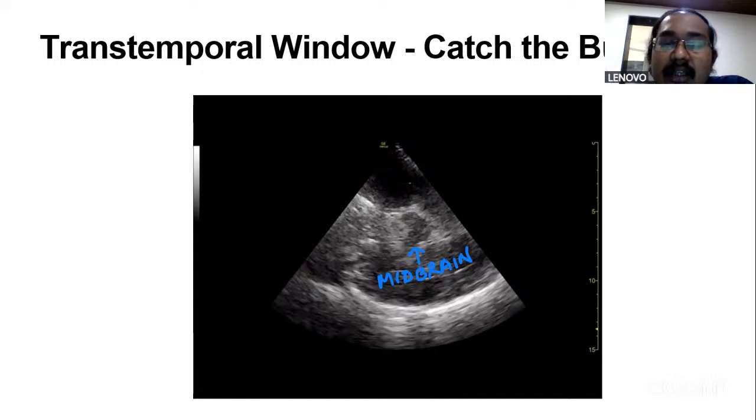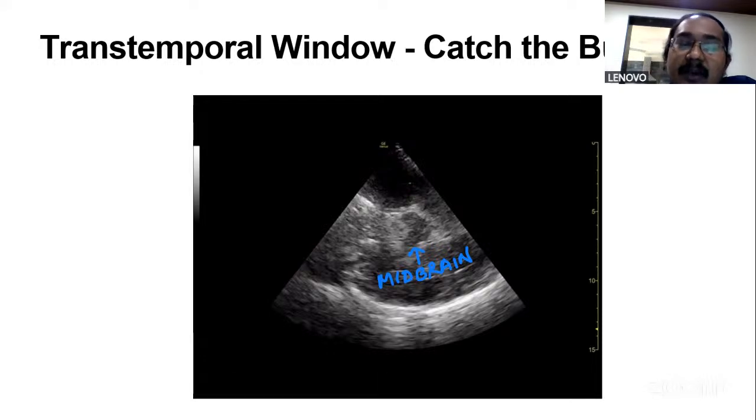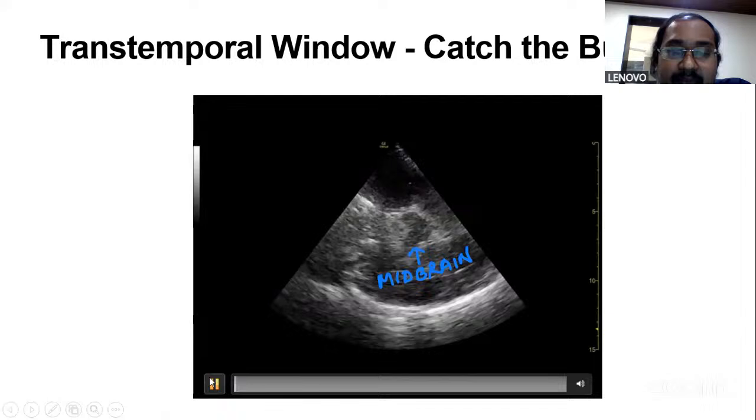these vessels. So here you can see that this heart-shaped or butterfly-shaped structure is the midbrain, and in front of it there is a temporal bone. What happens is the basilar artery comes like this. It divides into posterior cerebral artery, posterior cerebral artery. Now this is the temporal bone. At this temporal bone, at the anterior clinoid process, the terminal ICA enters and then divides into middle cerebral artery and anterior cerebral artery. Now we would like to see a video on it.